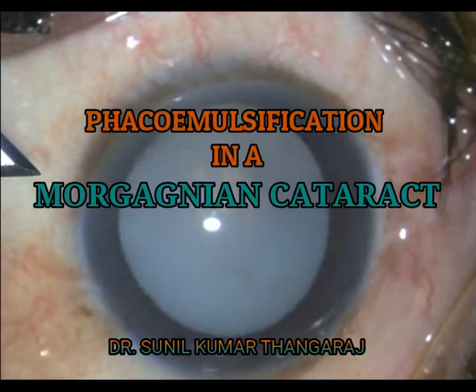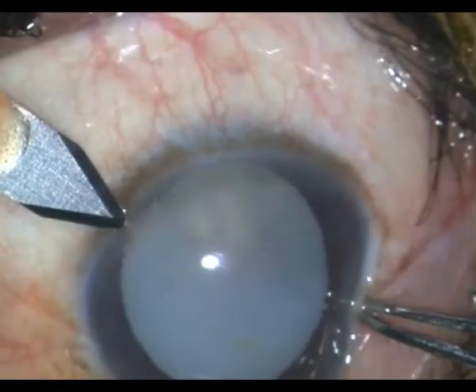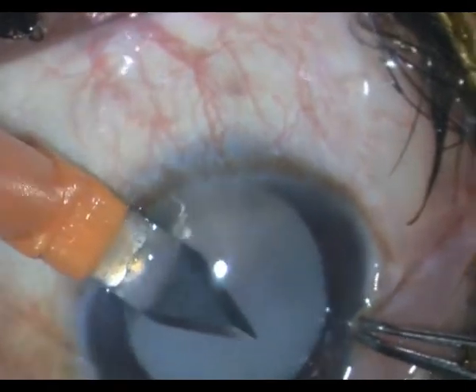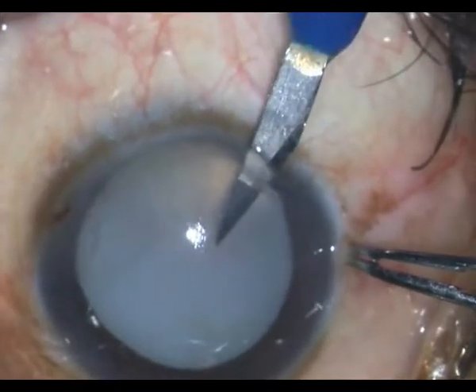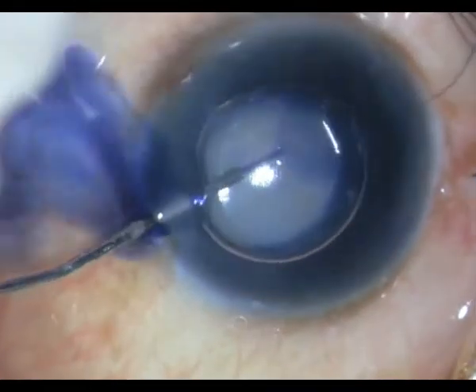In this video I will be demonstrating how I went about performing phaco emulsification in a hard Morgagnon cataract. Initially the steps are pretty routine. I performed my 2.8 mm incision and two side port incisions.